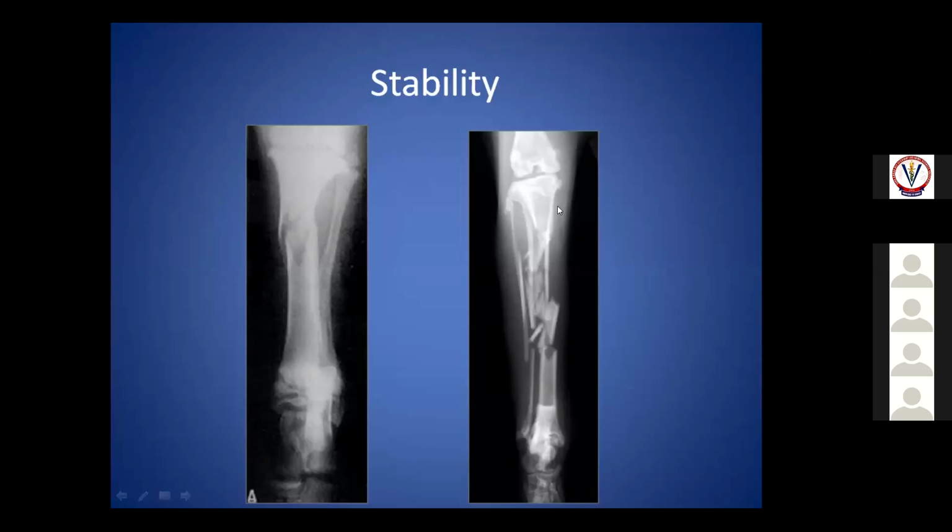You take the same radiograph, and in this particular case there are multiple pieces. You cannot count the number of pieces of this bone. So this is a tibial bone, and you can see the fibular fracture. The shaft of this particular part of the tibia is involved with a lot of bone chips. There are many fracture lines. So this we cannot classify as a stable fracture. So this is classified as stable, and this is classified as a highly unstable fracture.